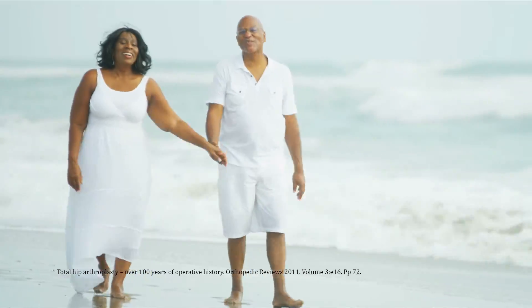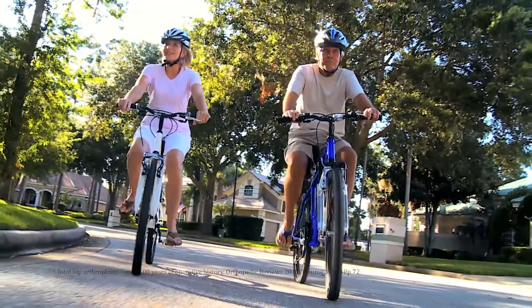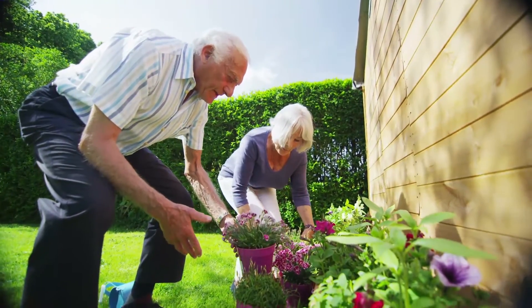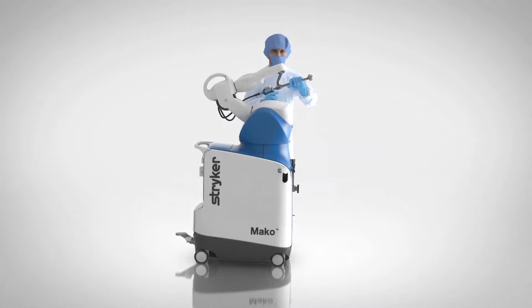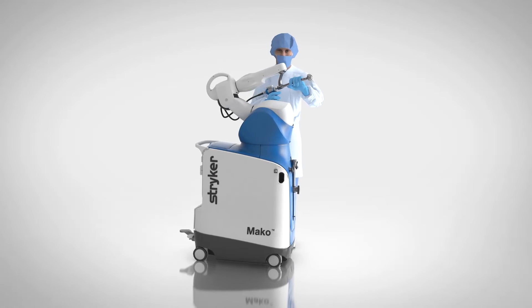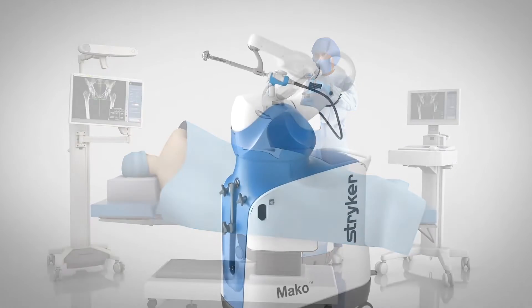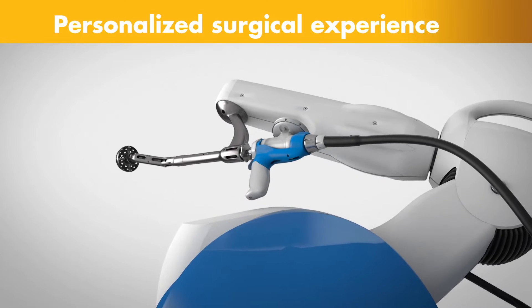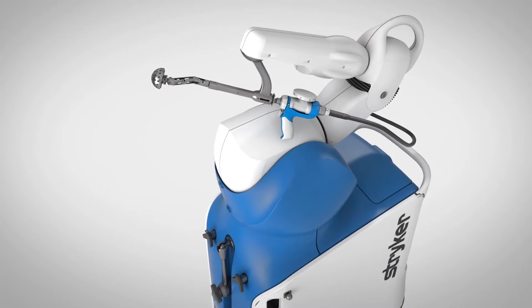For more than 100 years, joint replacement surgery has been used to treat patients with chronic hip pain. Meet Mako, a robotic arm-assisted technology used by surgeons to perform total hip replacements. This unique technology helps surgeons provide a personalized surgical experience, where each surgical plan is based on a patient-specific diagnosis and anatomy.